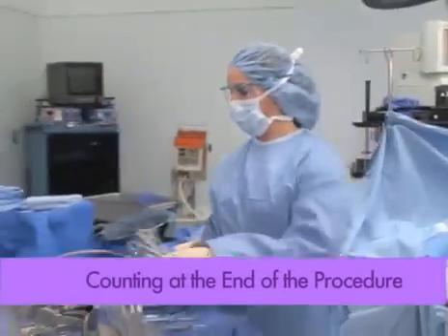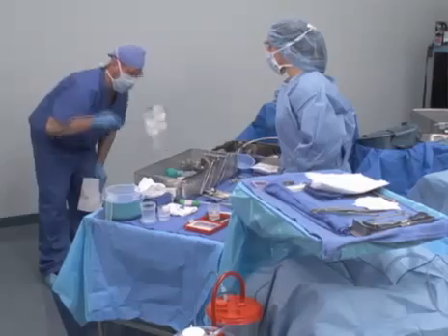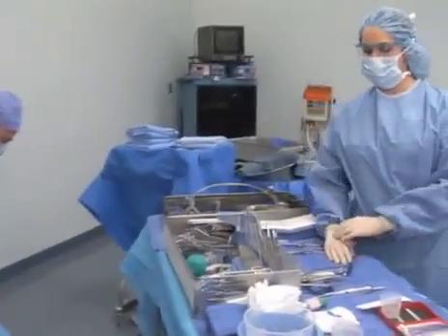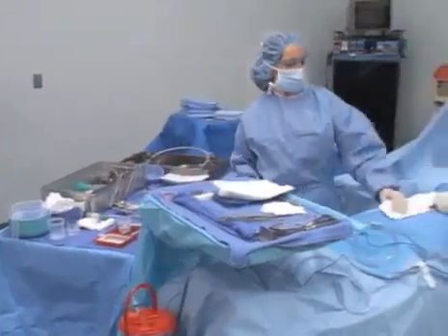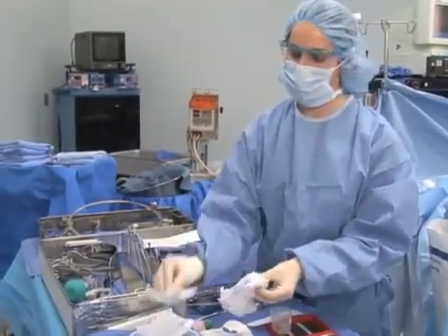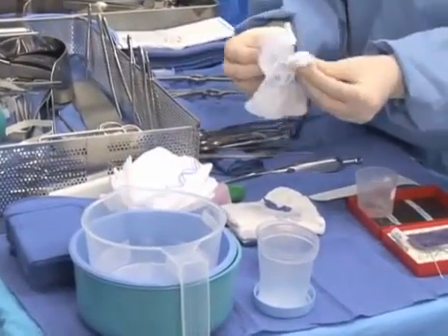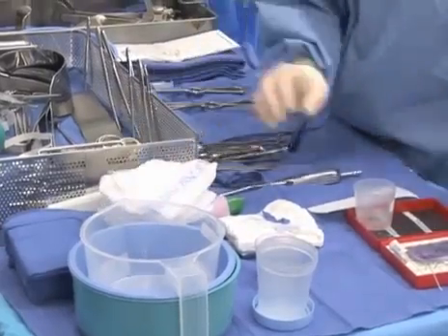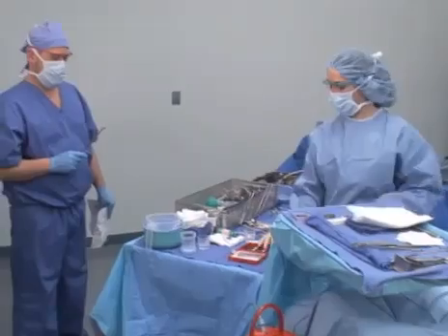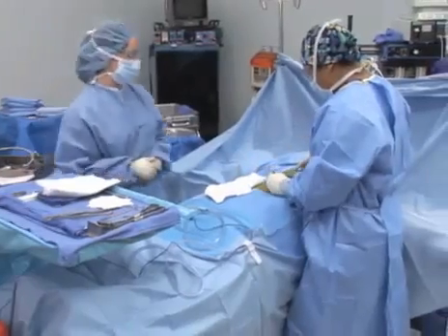Would you like to do a count? Lap sponges. 1, 2, 3, 4, 5. Raytec. 1, 2, 3, 4, 5, 6, 7, 8, 9, 10. Needles. 1, 2, 3, 4, 5. And blades. 1, 2, 3, 4. Your count is correct. Thank you.